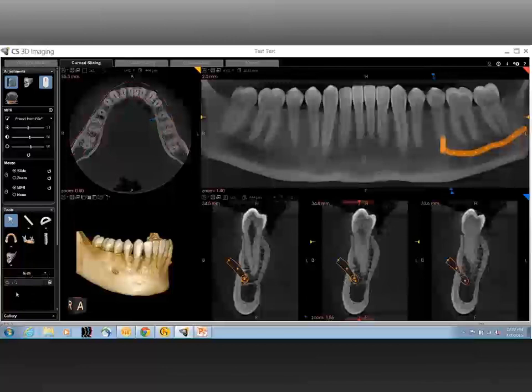So from what I'm getting, the clinician should note not just the pathological findings. They need to input these into a chart to record that the scan was actually evaluated. And if they're finding something in the scan that they're not confident of a diagnosis, they should look to an expert for those. Dr. Kottal, I do have one more question for you. I often get asked the question when dealing with a clinician who may not have a cone beam in-house. They ask me, do I have to scan the mandible if the panoramic 2D radiograph shows all the anatomy that is needed for implants? How would you comment?